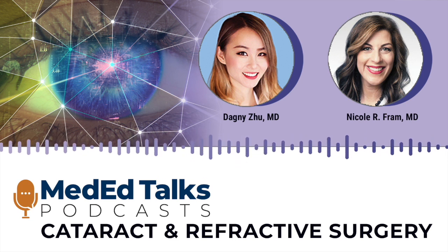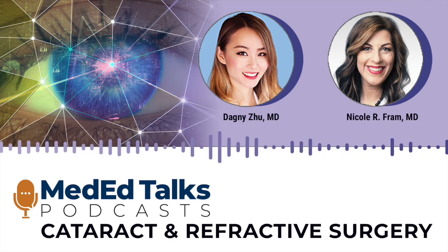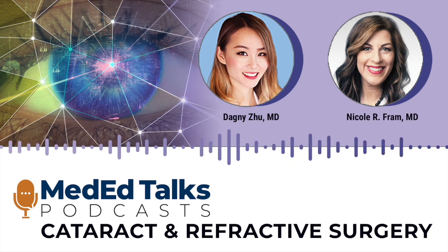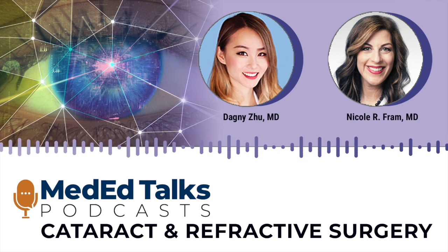So we're so lucky to be finally in the stage where people are using reference images that are going into software planning systems that then go directly into our microscope. And then we can see it overlaid on the eye to find the steep axis. So, for example, if I use an IOLMaster 700, that reference image can go right into a software planning system, Veracity, that can then go into a Callisto in the microscope and then overlay where the steep axis is.